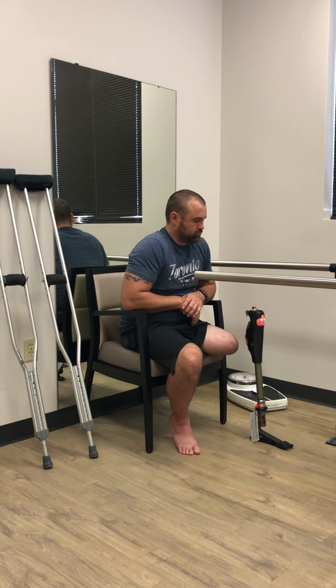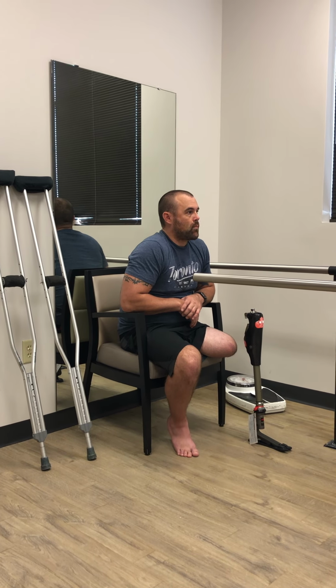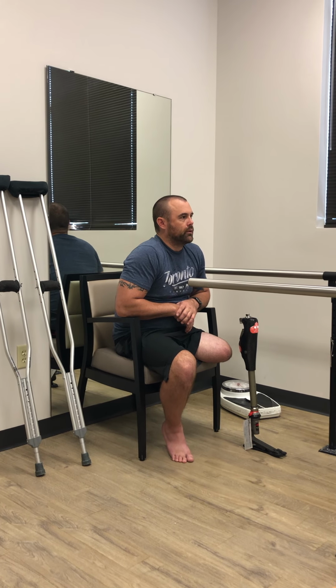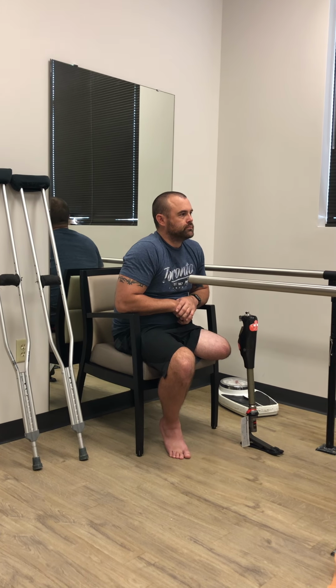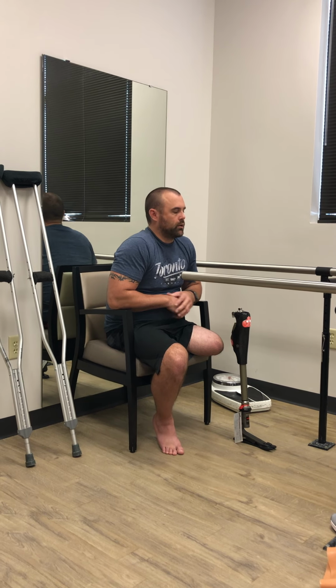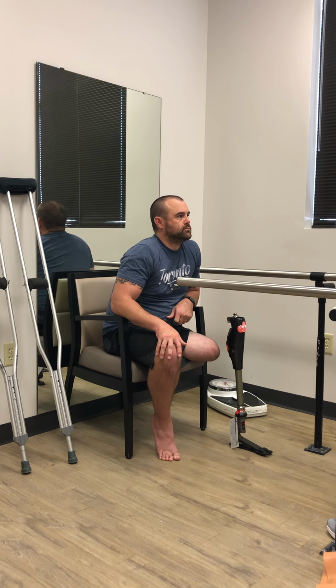So tennis shoes also weigh nothing. The only problem is a metal toed shoe, which, if that's what you have to wear, some sites require. Yeah, that's fine. What we'll probably wanna do is have you bring both your shoes in, because the heel height will change your alignment. So you will have to stay fairly close as far as heel height goes.